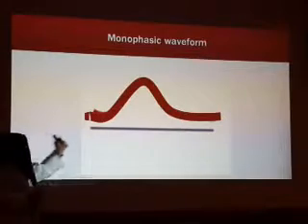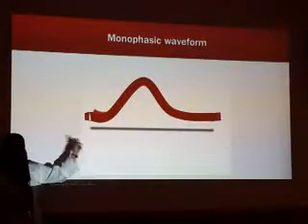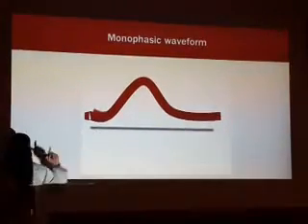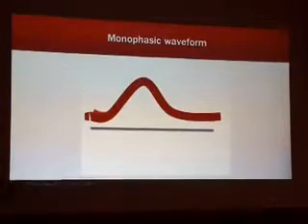If I'm seeing this peak في extremity، في the common femoral artery، في subclavian artery، there is a pathology. I have to look for it. This is abnormal waveform. If I saw this waveform في dorsalis pedis, it's abnormal. I have to go up to look for where is exactly the occlusion or stenosis. So just memorize it. البريفرال الهاندز والليجز it should be triphasic biphasic. الاورجن intra-abdominal monophasic. إذا كان في reverse so abdominal. Okay?